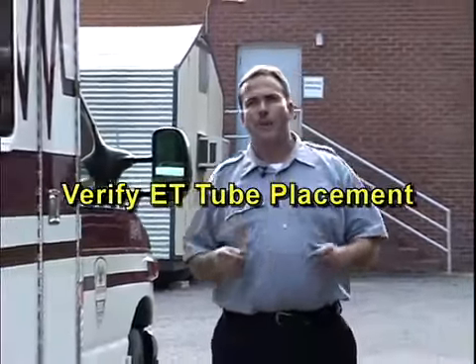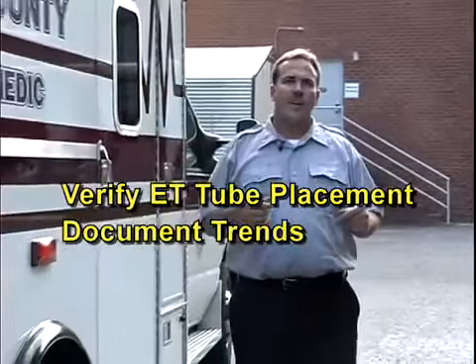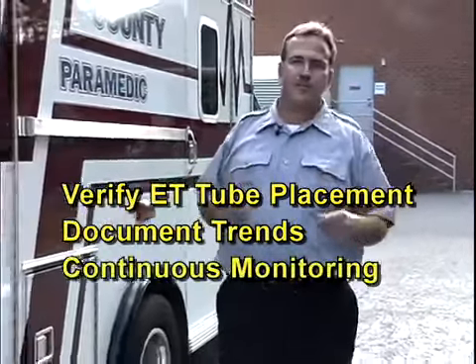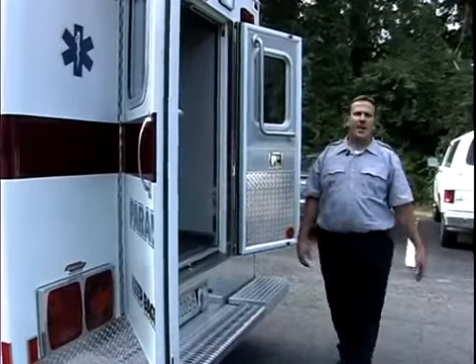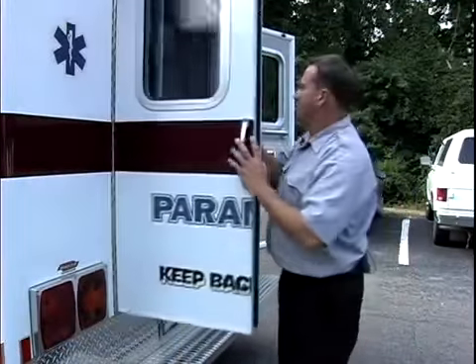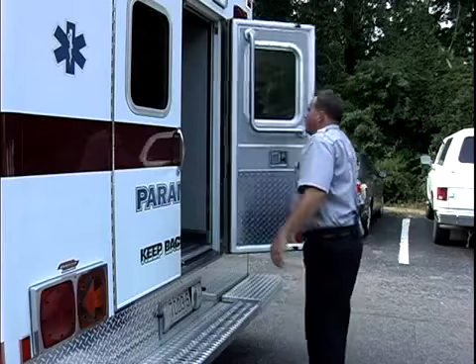We've covered several scenarios where capnography has become the standard of care in EMS. Using capnography in the pre-hospital setting will have an immense benefit for a wide variety of your patients. Bringing this technology to your agency will have an immediate impact on your patient care. You can verify ET tube placement, document and track trends, and continuously monitor your ventilation and perfusion status. In summary, if you're using capnography, keep doing so. If not, it's time to get started.